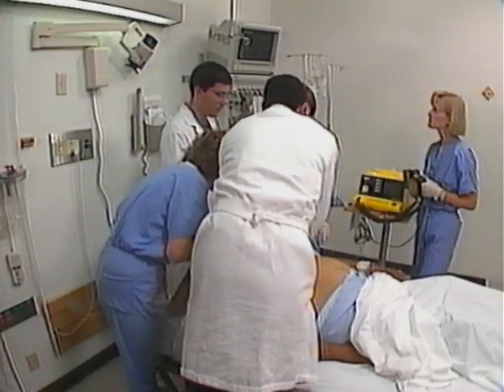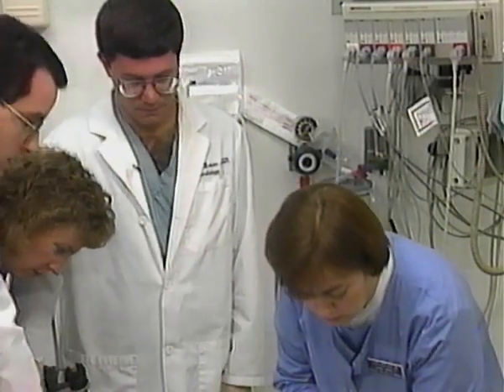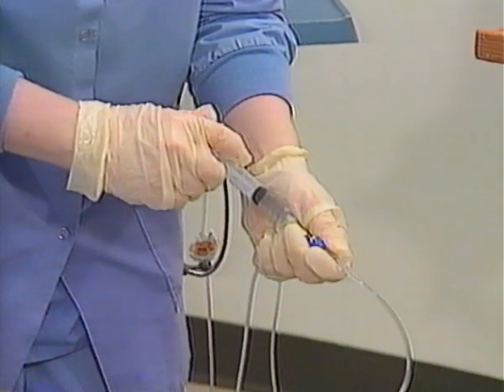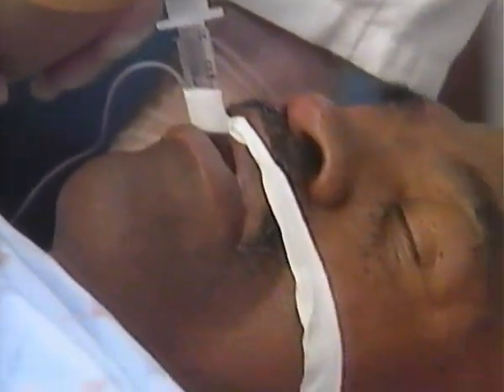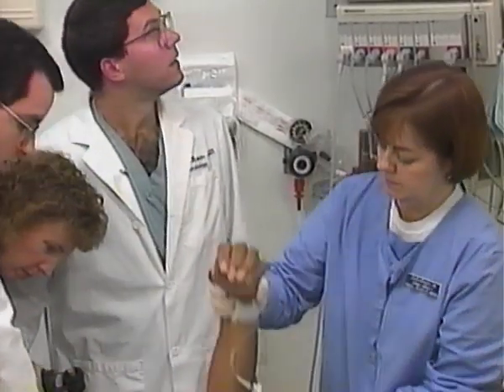There's no pulse. He's still in VFib. Let's go ahead and start CPR. Let's give him 5 milligrams per kilo of bretylium. I think he may be having an infarct. Is his first set of cardiac enzymes back? The first set's back. His total's high, but his ISOs aren't available yet. Bretylium's in. Still have VFib.